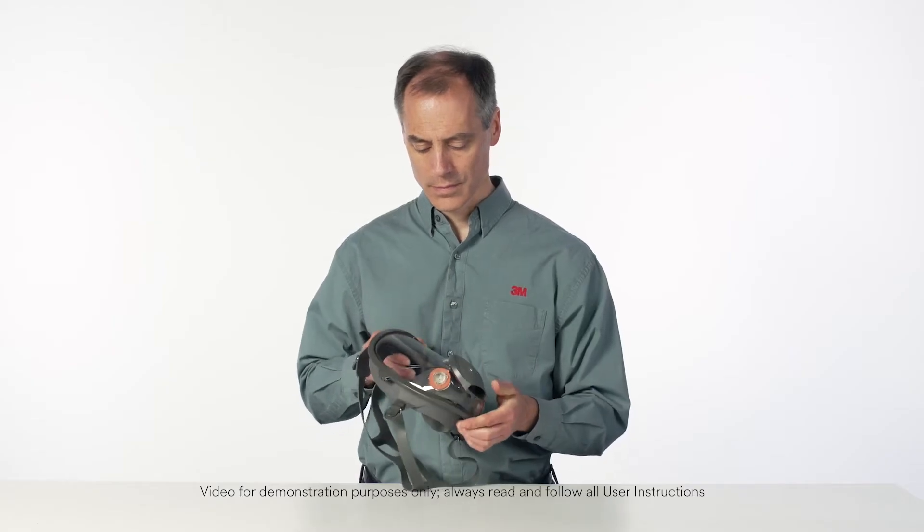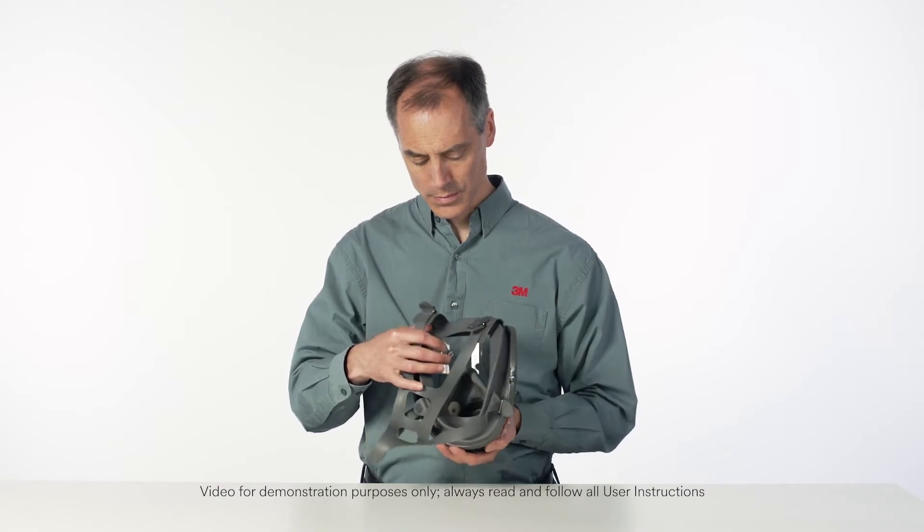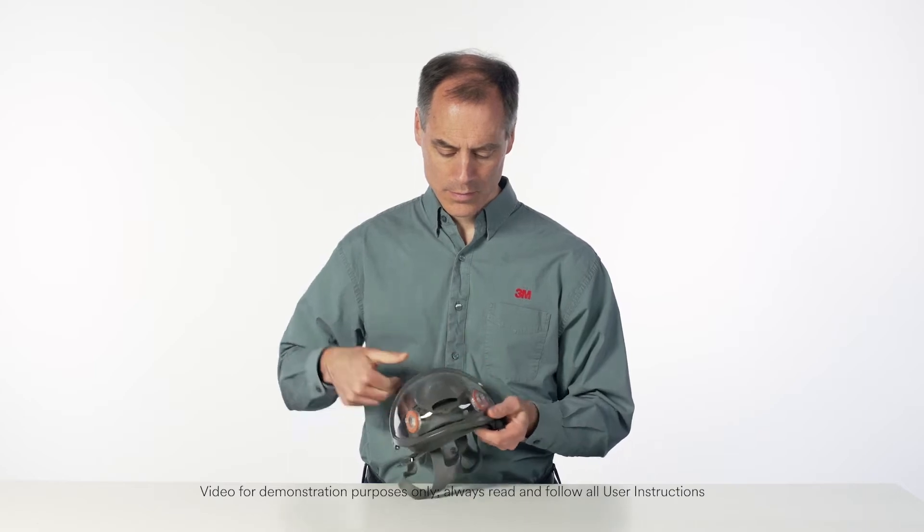Failure to follow all instructions and limitations on the use of this respirator, and/or failure to wear this respirator during all times of exposure, can reduce respirator effectiveness and may result in sickness or death.